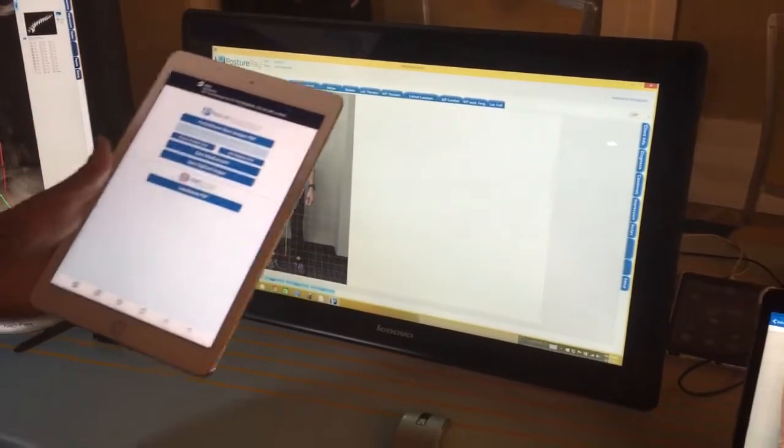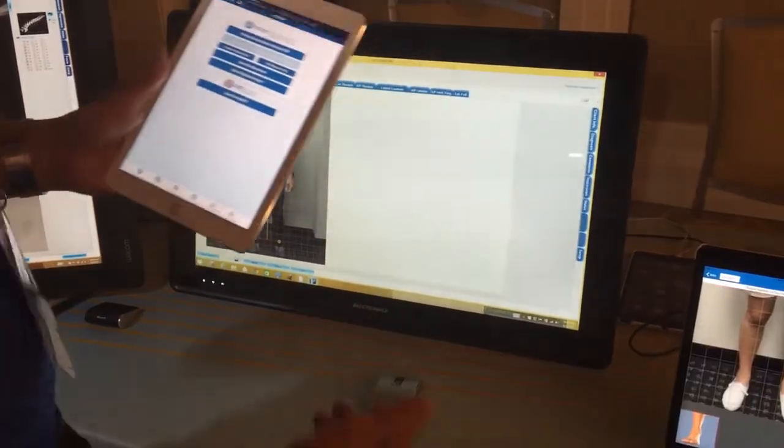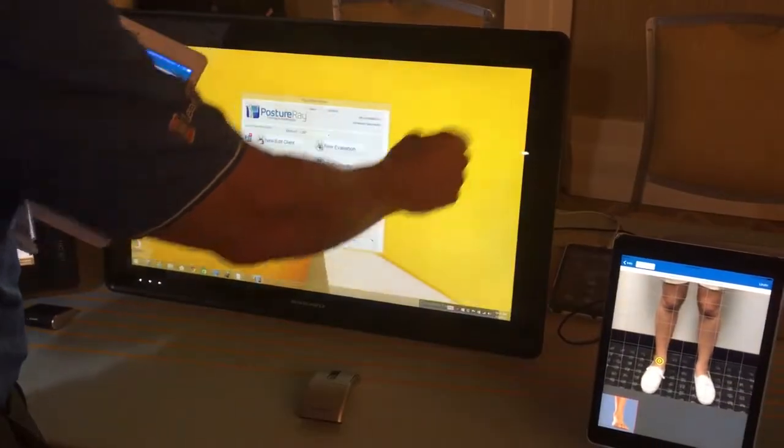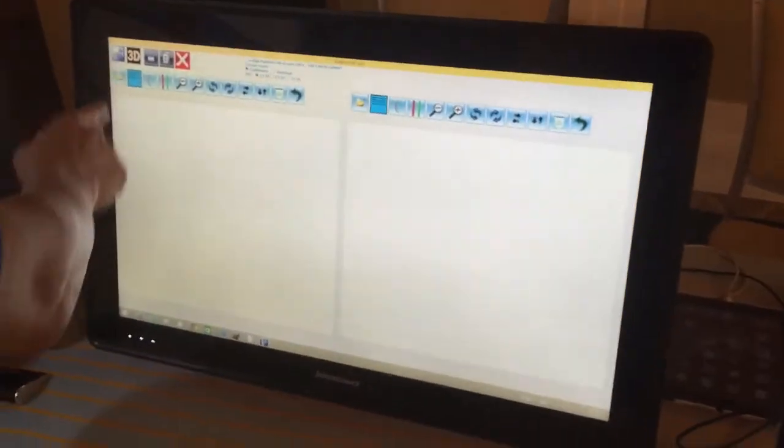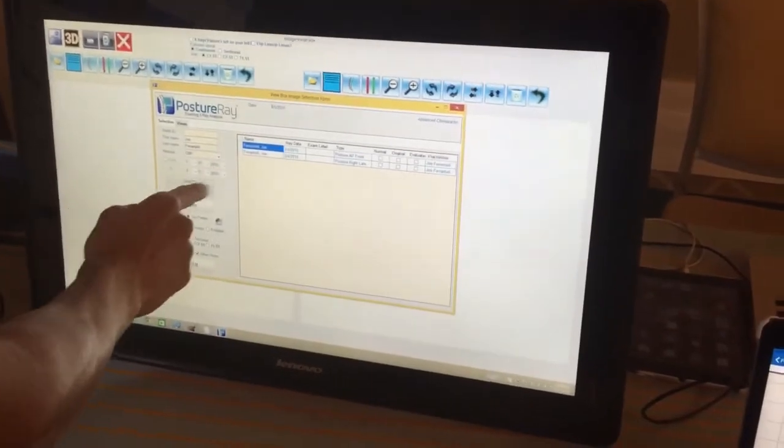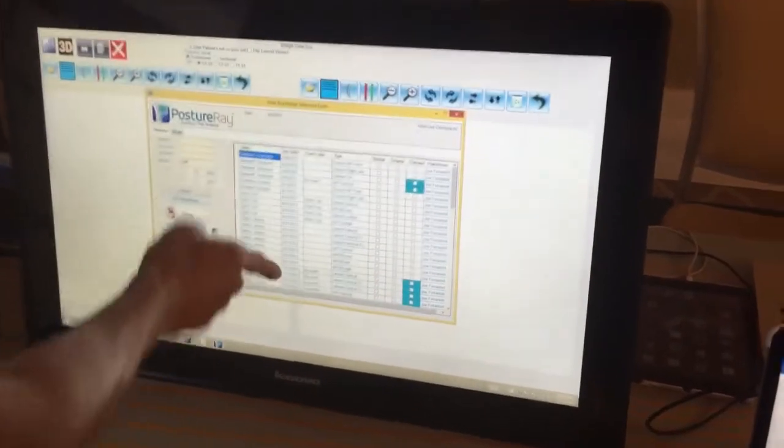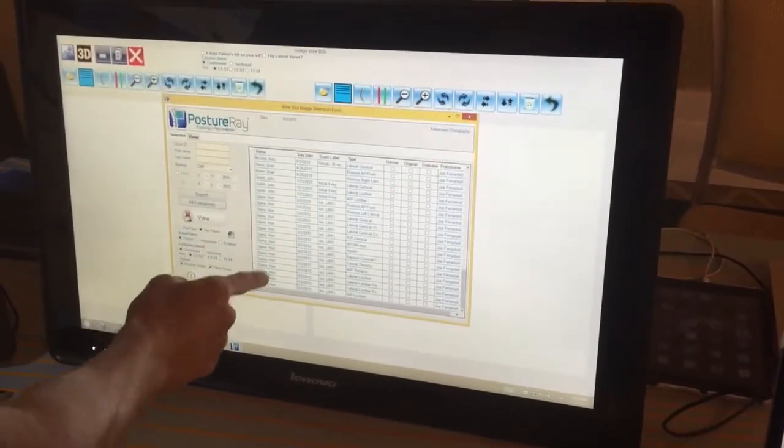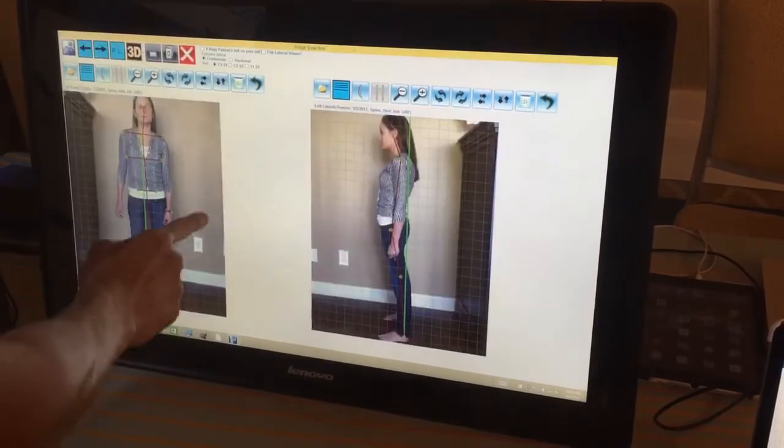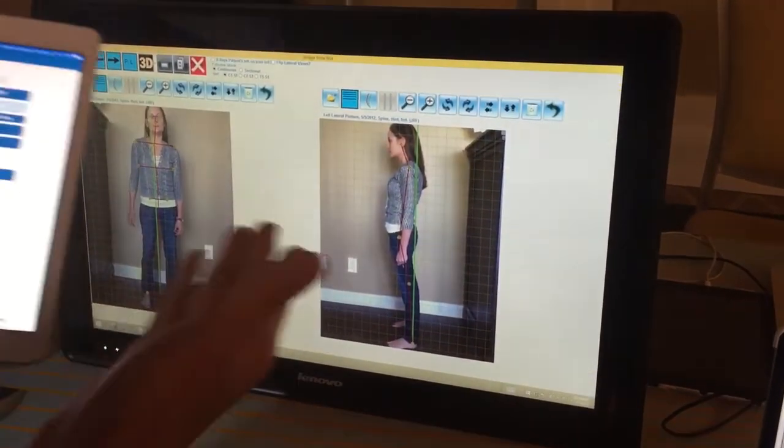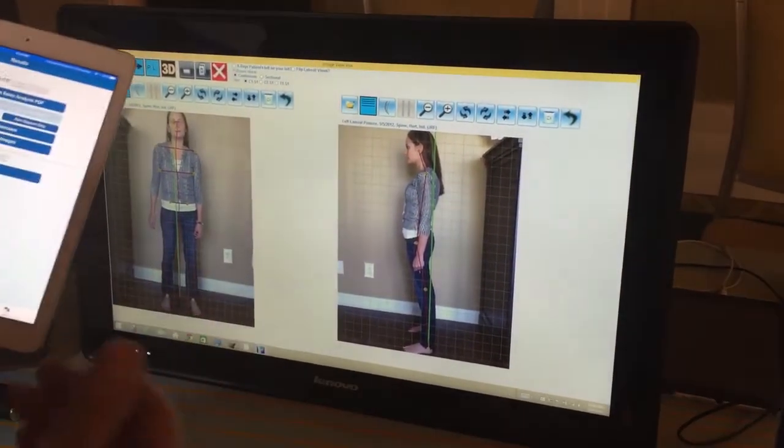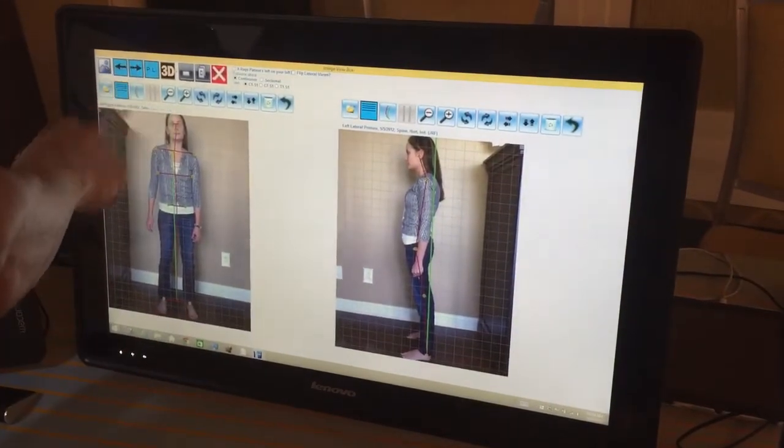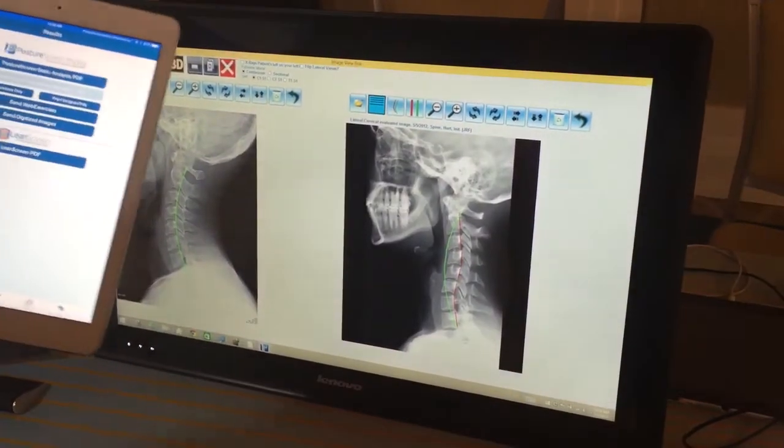The cool thing about that is obviously if we're ready to do a report of findings on somebody—I'll pick somebody that we already have—the idea is that we can pull in the posture exams very easily so that we don't have to manually load them, and then of course we can jump right into the x-rays.